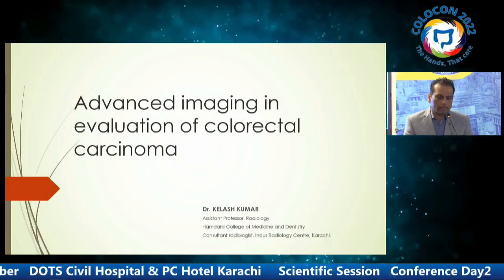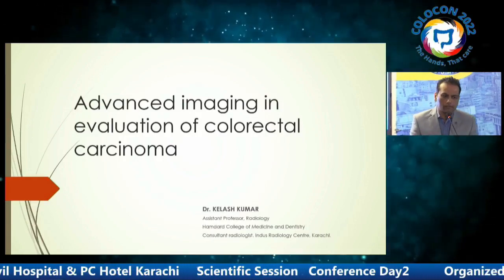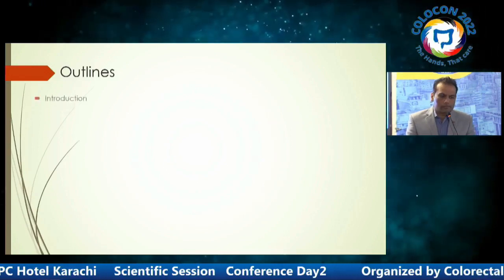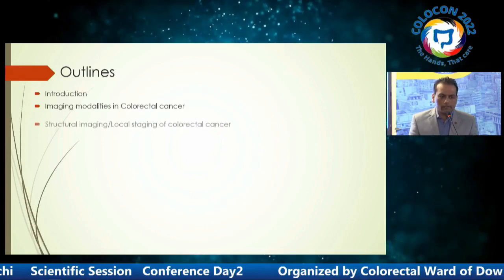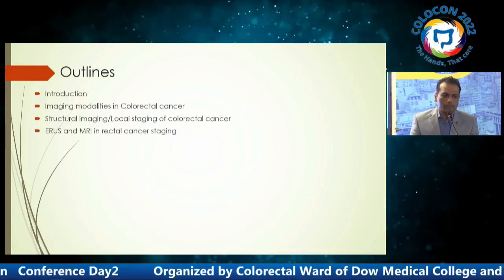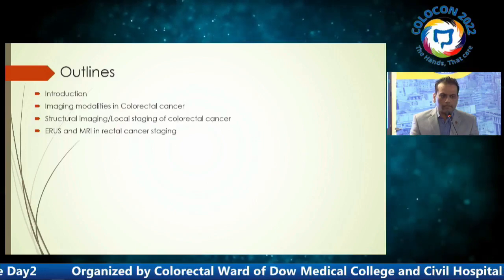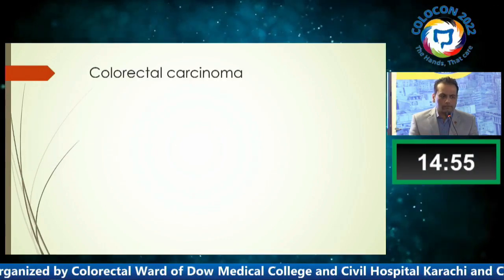Today I have been given a topic of advanced imaging and evaluation of colorectal carcinoma. So we'll be discussing the introduction, the imaging modalities in colorectal cancer, and structural local staging of colorectal cancer with focus of endorectal ultrasound and MRI in rectal cancer staging, and conclusion.